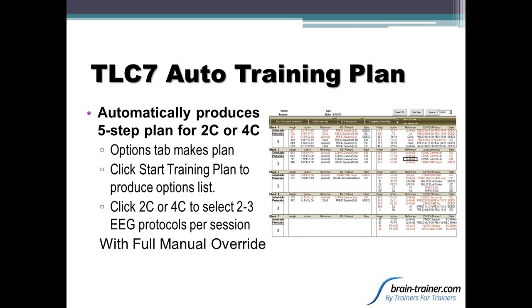So it gives you something which you can use out of the box, and people who are doing that, literally trainers who are starting off in neurofeedback, are getting very, very good results just using the auto plan. But almost everybody, as they get into it more and they get more comfortable looking at the assessment and they have their own experience of what kinds of things have worked with the kinds of clients they work with, they have the complete ability to customize the plan for themselves.